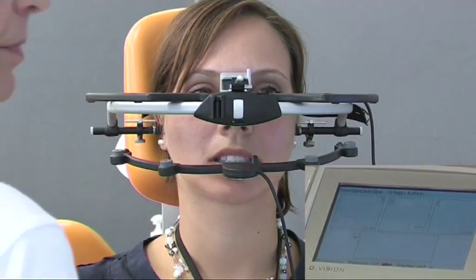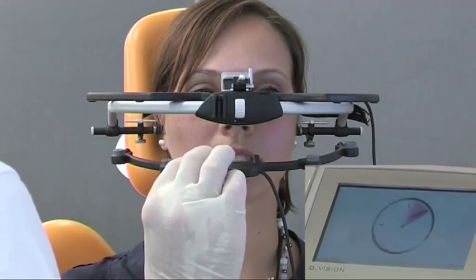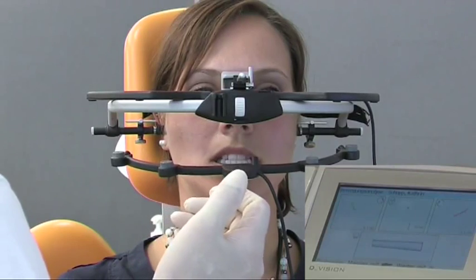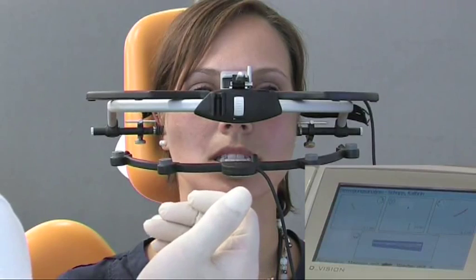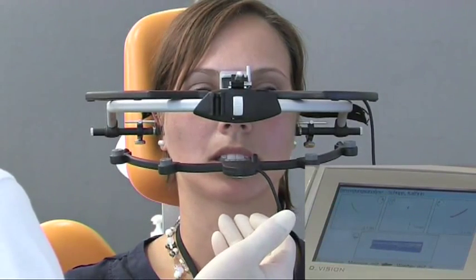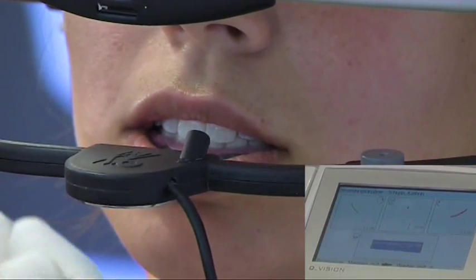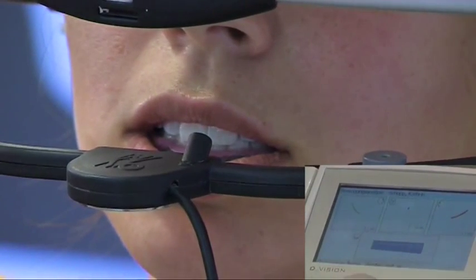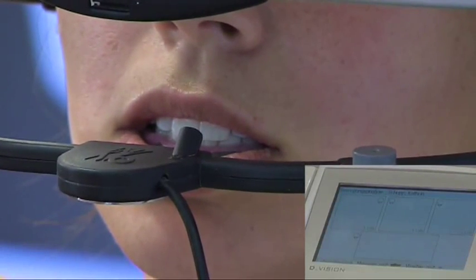Next, several protrusion movements are registered. With tooth contact, please move the lower jaw backwards and forwards several times. The measurement is ended and stored.